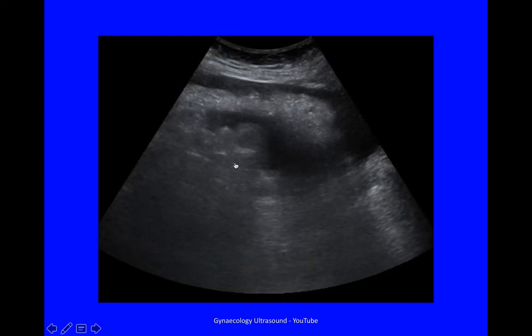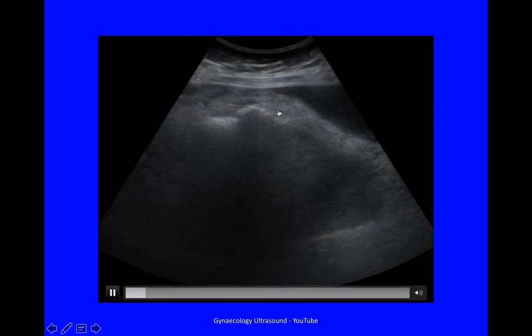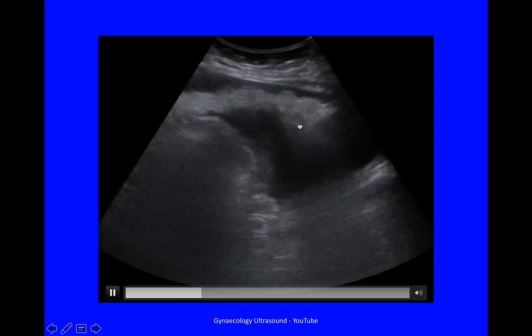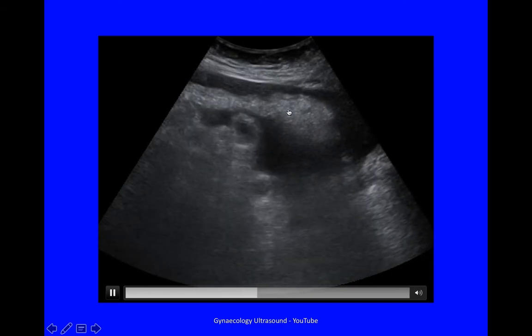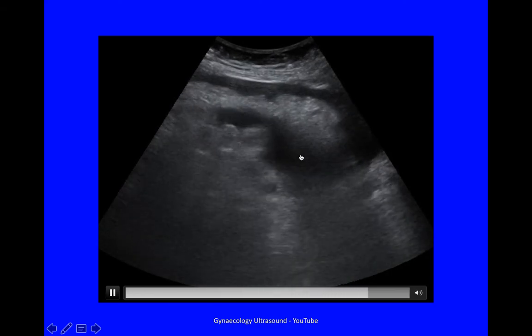Longitudinal view, transabdominal, omentum with a tumour deposit, just there, floating in the ascites.